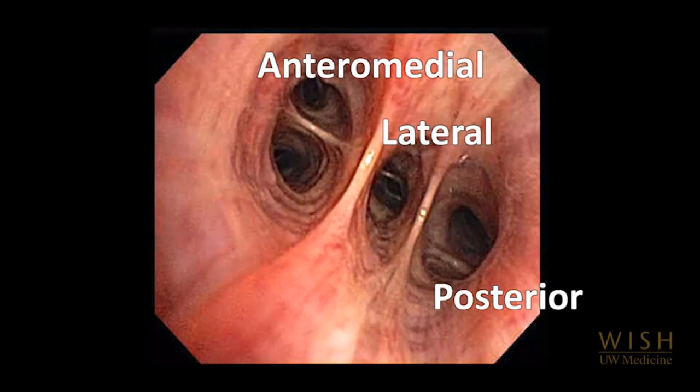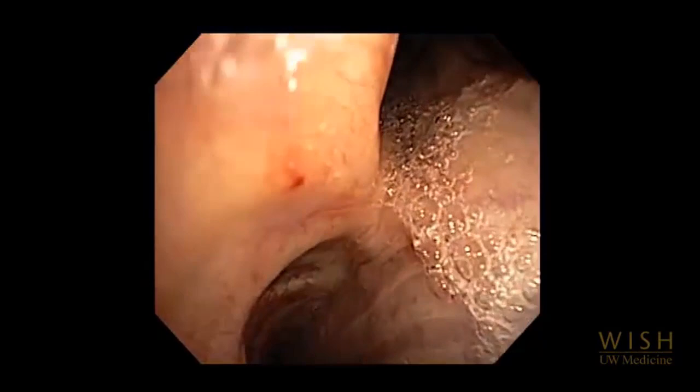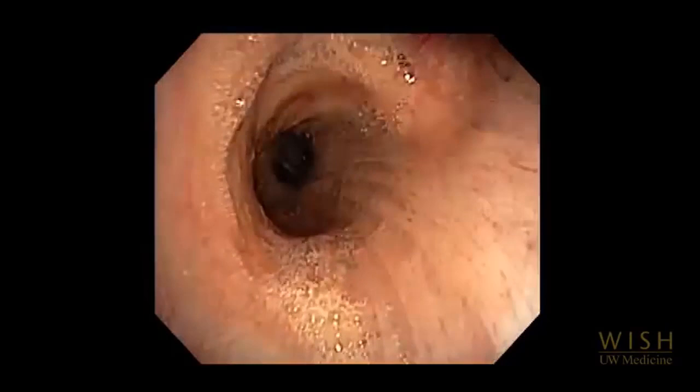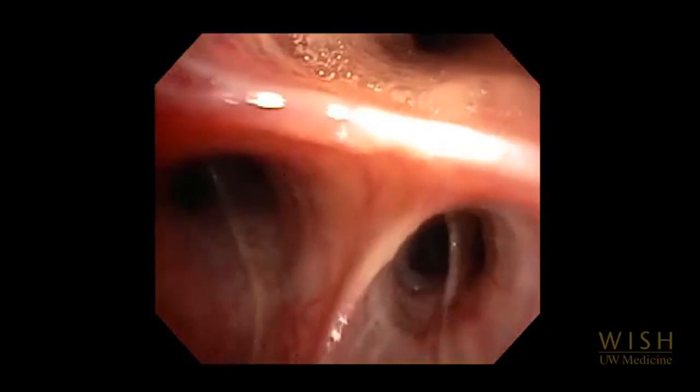After completing full inspection of one lung, return to the main carina to begin inspection of the other. The bronchoscope is entering the right main stem. The distance from the main carina to the right upper lobe bronchus is shorter than from the main carina to the left upper lobe bronchus. The right upper lobe bronchus takes off anterolaterally. The right upper lobe trifurcates into three segments. It can be hard to see all of these at the same time. Here we clearly see the anterior and posterior segments. The apical segment is just visible.